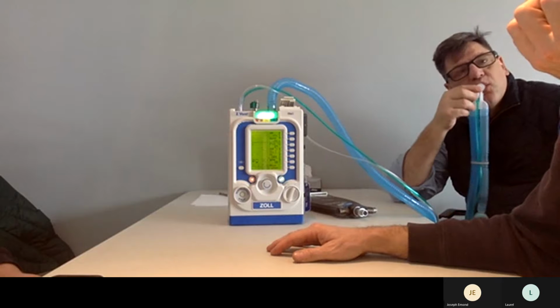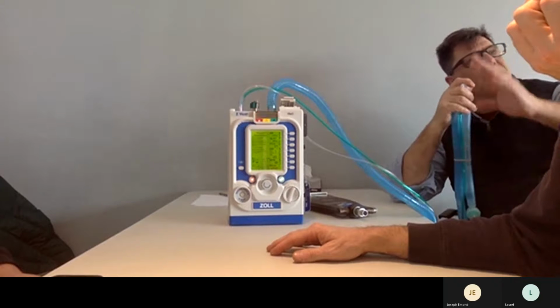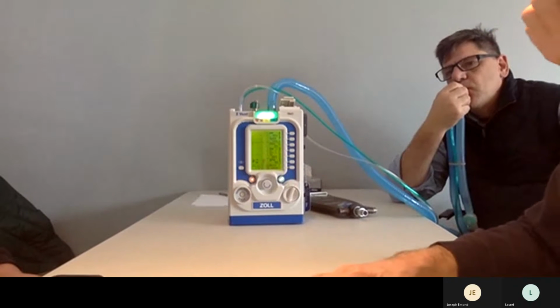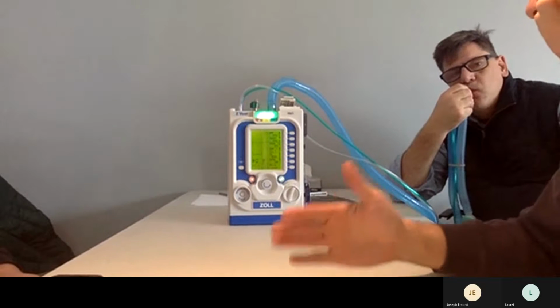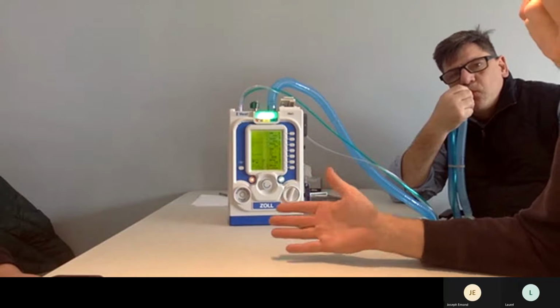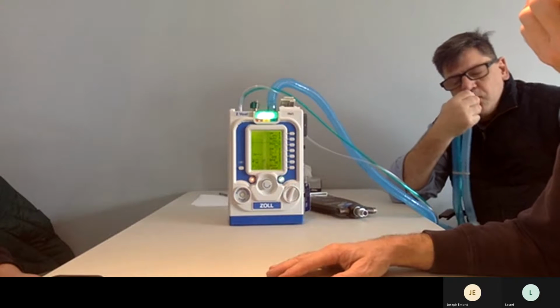Tell me what your volumes and rates are at. Our volume is going to 352 there. Rate is 21, 22. Now back up, so you're changing anywhere from 300 to 500. Again, that's inhalation, exhalation, up, down. It's giving you what you draw, so you're not going to breath stack with it.